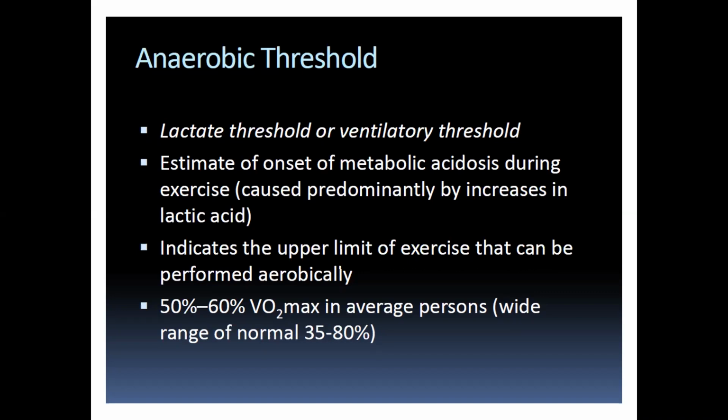If you hit this anaerobic threshold early, like less than 40% of the total exercise, that is abnormal. What does that mean? It means that very early on during exercise, your heart is giving up and it's not able to deliver the oxygen to the skeletal muscles. So less than 40%, if you hit anaerobic threshold, is a marker of cardiac limitation. I hope that's clear. Now, how can you figure it out?